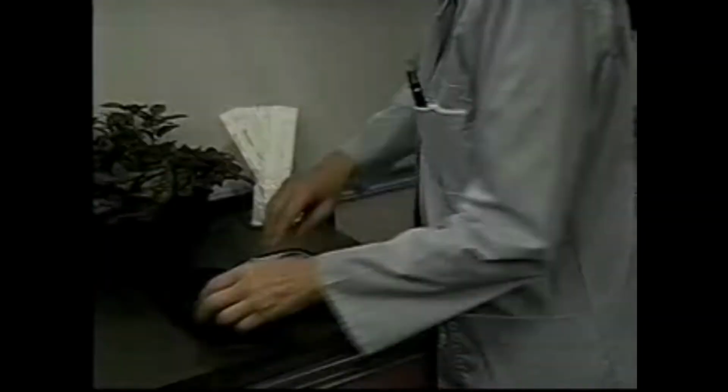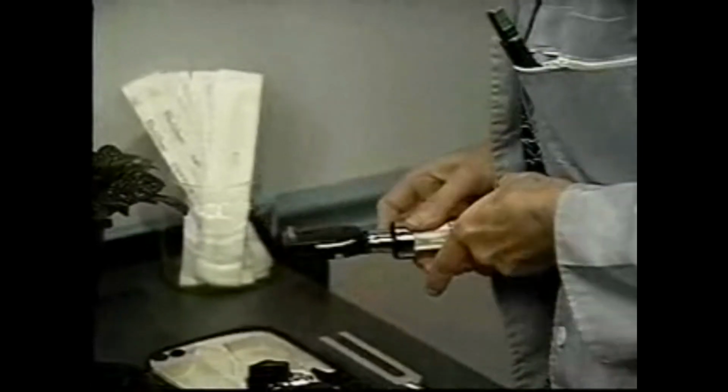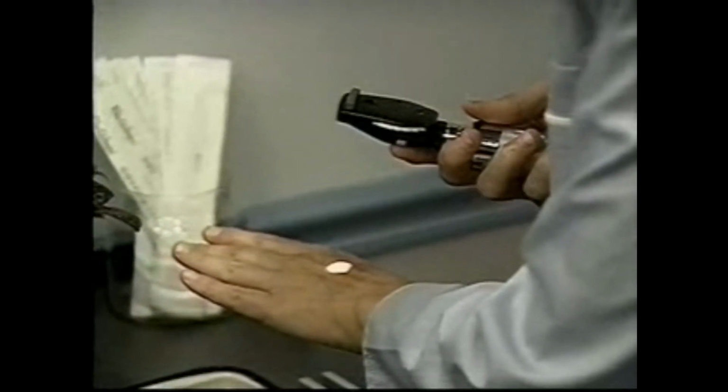To test for convergence, observe as the patient's eyes watch your finger move toward the bridge of the nose. Normally, the eyes converge and follow your finger to within 5 to 8 centimeters of the nose. When you're ready to examine the fundus, switch on the ophthalmoscope light and adjust it to the large round beam of white light. Also, make sure the light is bright enough.